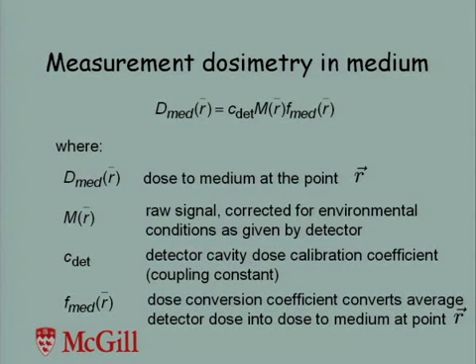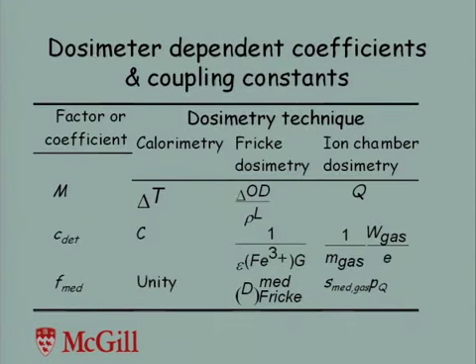And so the challenge is to determine, in fact, both these factors. The C factor has to do with fundamental physics. We cannot calculate it easily. The F factor is clearly a dosimetric question, and it's this F factor that deserves attention when you talk about non-standard beams. Just a table to illustrate for different techniques what these factors become.